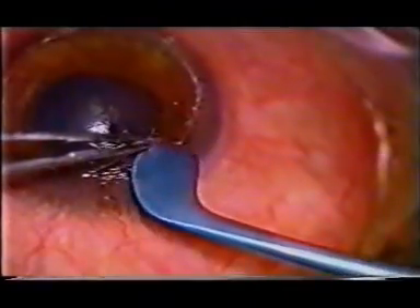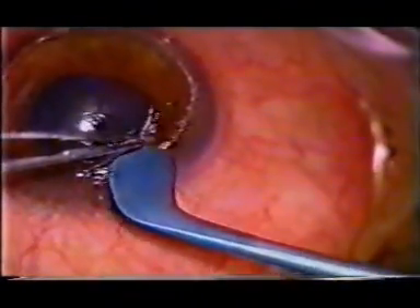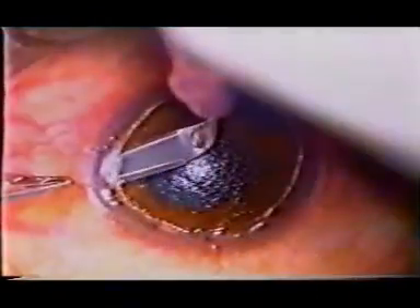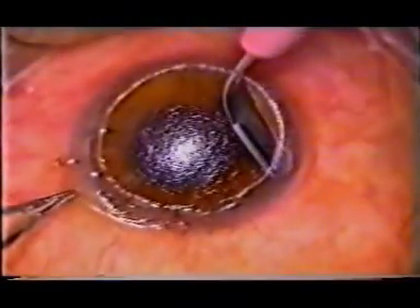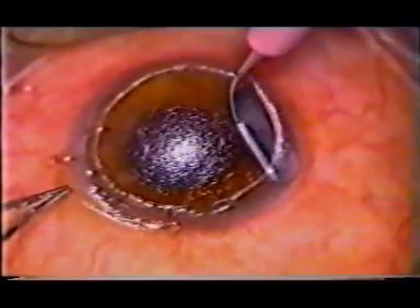A two-staged lamellar dissection of the host bed was done. Following complete dissection of the bed, an intrastromal pocket was created in the periphery circumferentially. A full thickness graft of 12.5 millimetre diameter was punched and the endothelium was scraped off.